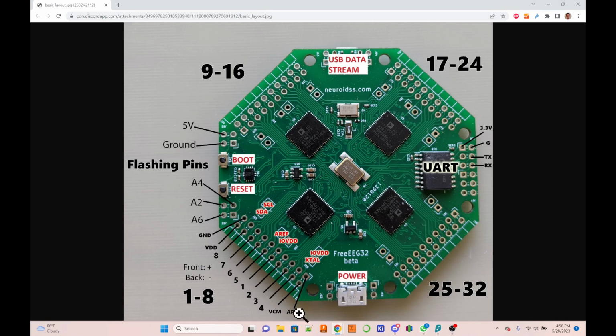I don't know what we do with AREF. I haven't touched it. If you make a headset, I don't think that's what you use, but you do use this when you interconnect multiple boards. But for headsets, AREF is not used, but for other stuff, AREF is used. So I'm going to stay away from AREF because this is all I know about AREF. I'm not a programmer, I'm not an electronics guy, I'm more of like the headset kind of guy.